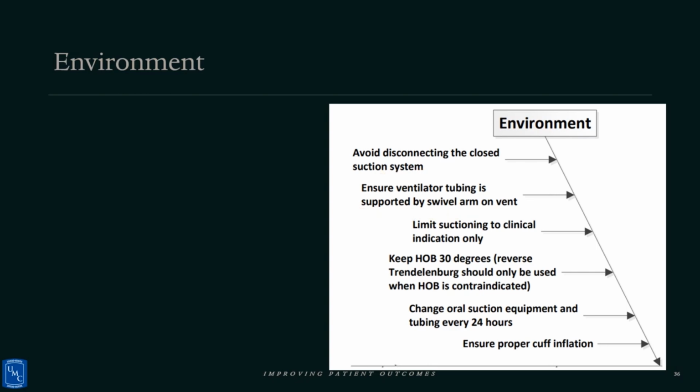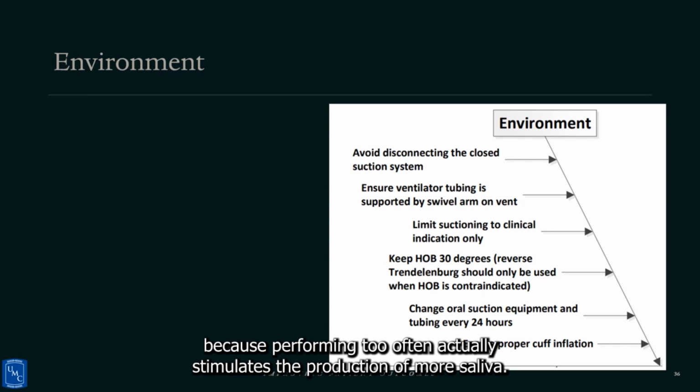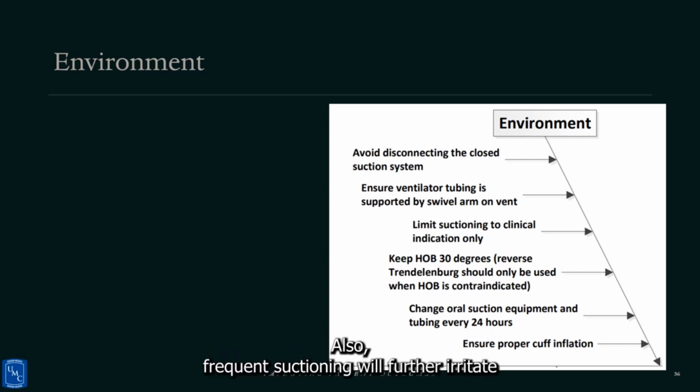Limiting suction to only performing when clinically indicated is important because performing too often actually stimulates the production of more saliva. Also, frequent suctioning will further irritate the airway.